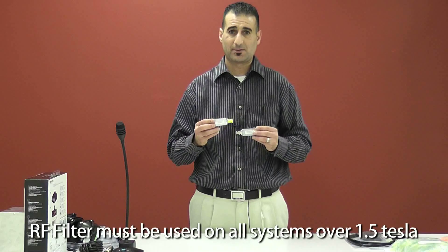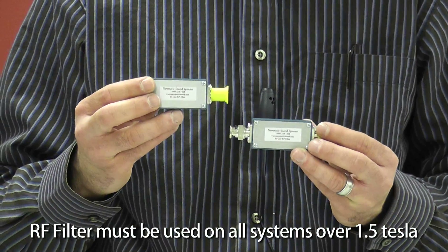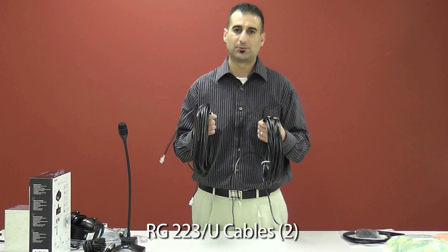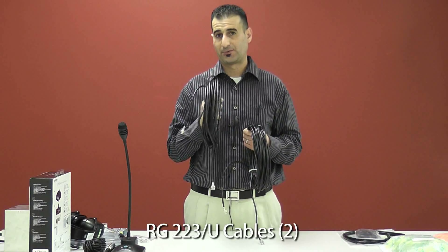These are our radio filter boxes, which are mandatory for systems anything above 1.5 Tesla. Next we have our BNC and RCA adapters — you will receive one set. Next we have our RG223 cables. These will be the hardwiring from the penetration panel on the MRI side, plugging right into your transducer.